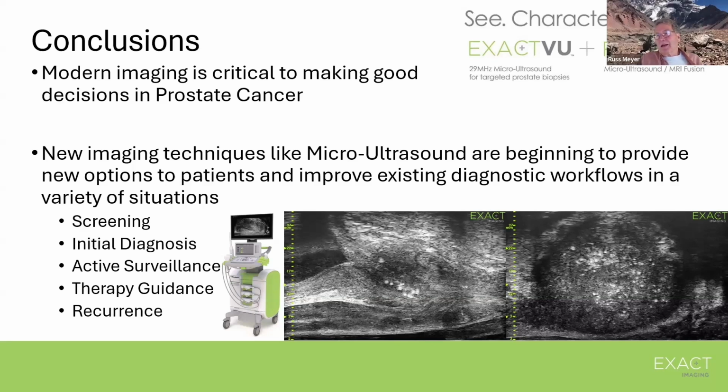I would add a flavor variation to that question, because I think it came up before. Some people, before doing biopsies, do MRIs, and that's very clear for identifying tissue issues. But in the end, it doesn't totally replace a biopsy. It's more validation of a biopsy.